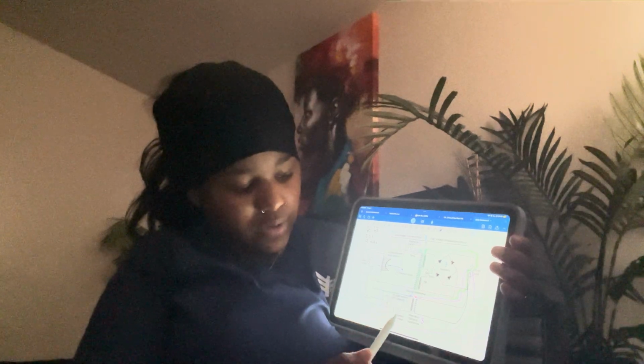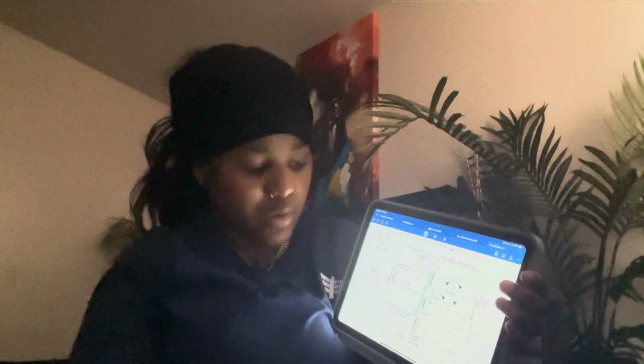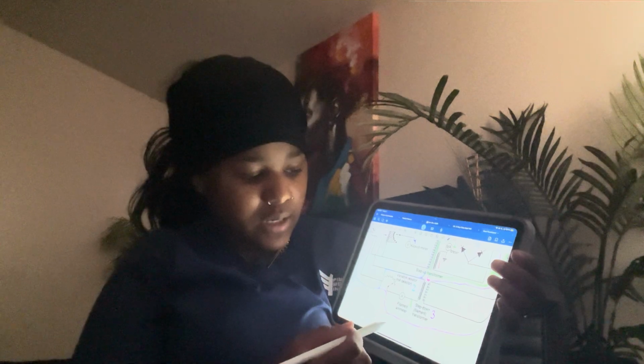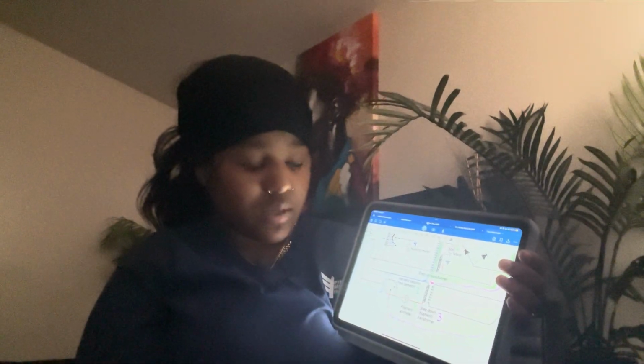So we're going to go down here to the filament side of the X-ray tube, which is very important. The filament ammeter is very important because this is what produces the thermionic emission. This is pushed towards the anode to create X-rays.